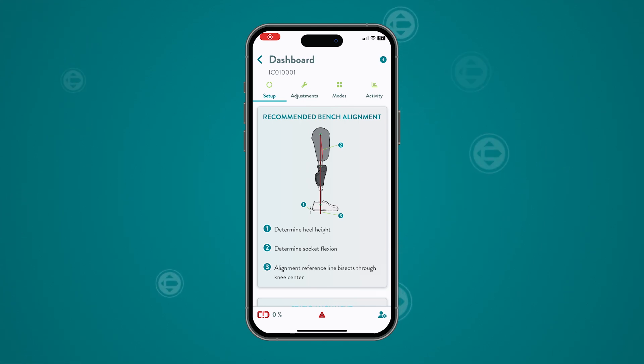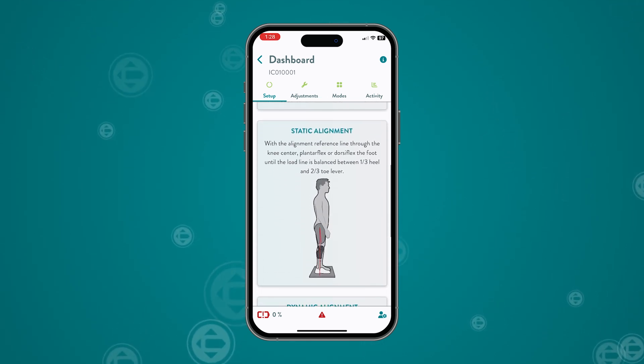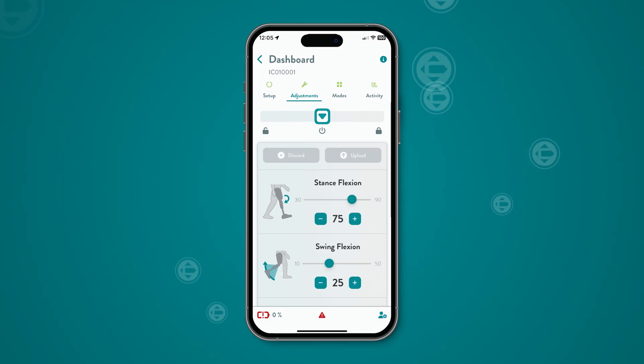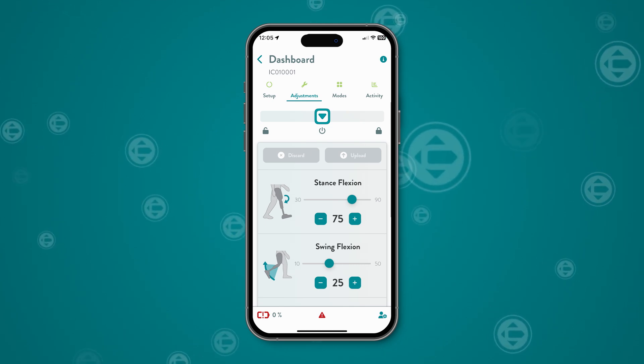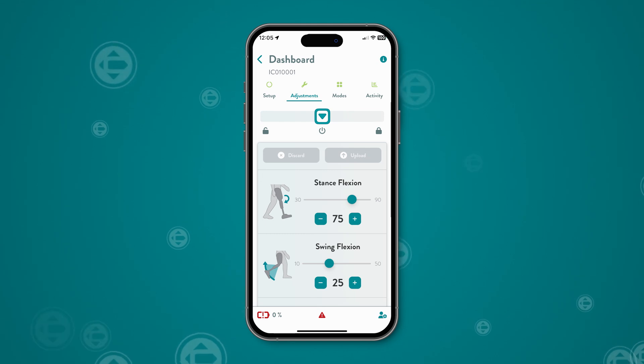The setup screen guides you through the physical setup of the knee with basic alignment guidelines for bench, static, and dynamic alignments. Once static alignment is complete and dynamic alignment is ready to begin, you can adjust the resistance settings in the adjustment screen. The resistance settings are accessible to prosthetists only and cannot be adjusted by the end user.